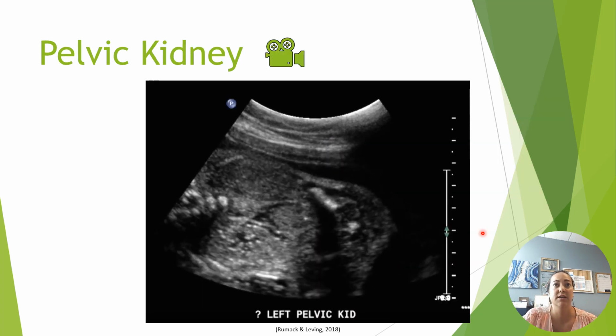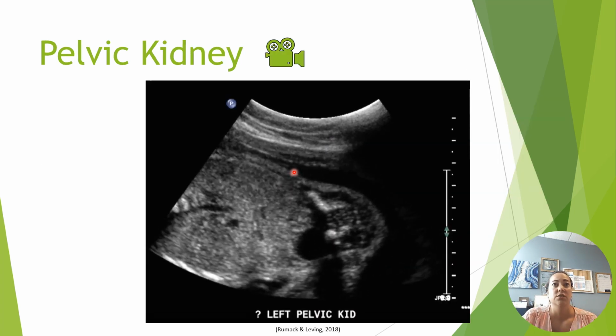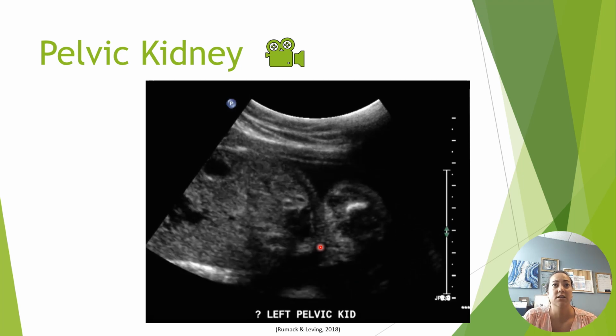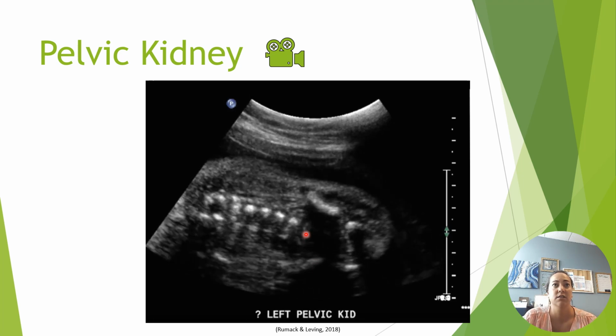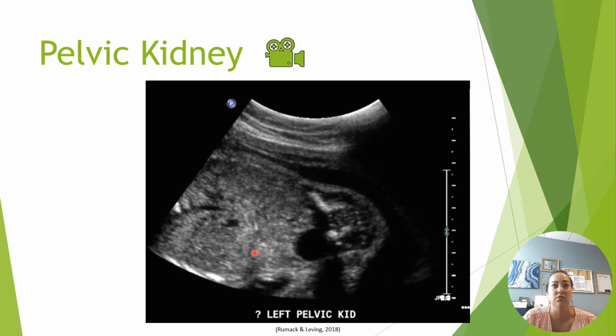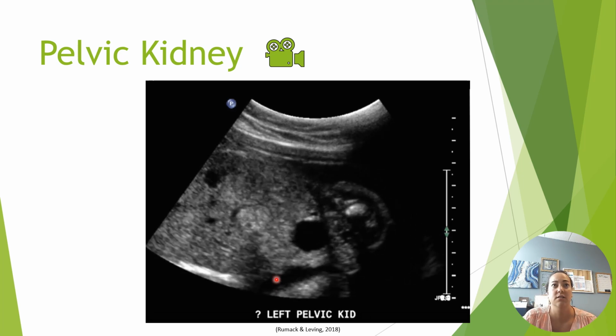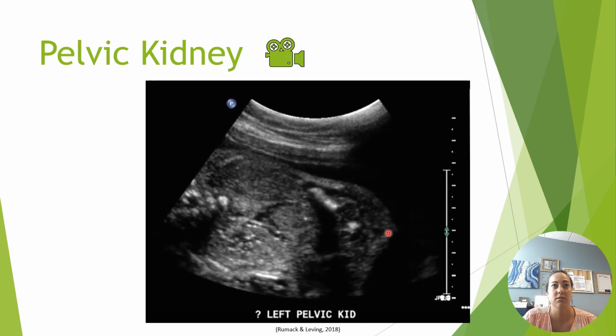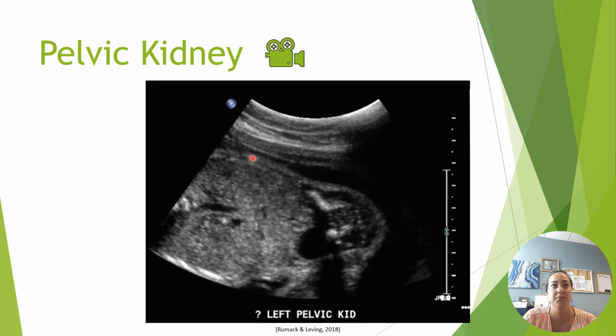Here is a cine clip showing the bladder here and kidney tissue there. I believe we saw normal kidney tissue up here. Normal kidney there.